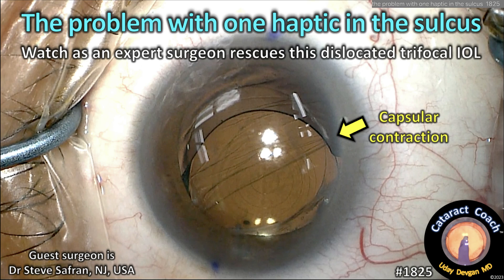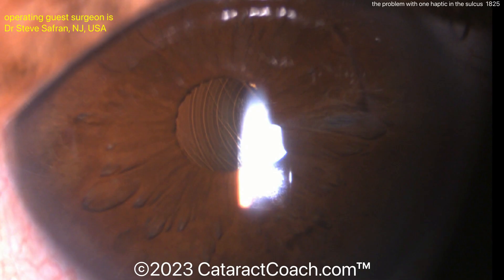CataractCoach.com. The problem with one haptic in the sulcus is this: a dislocated lens. Watch as our expert surgeon rescues this difficult case.